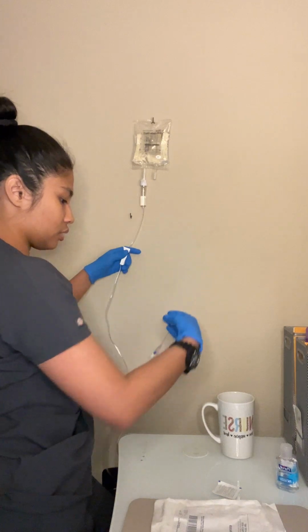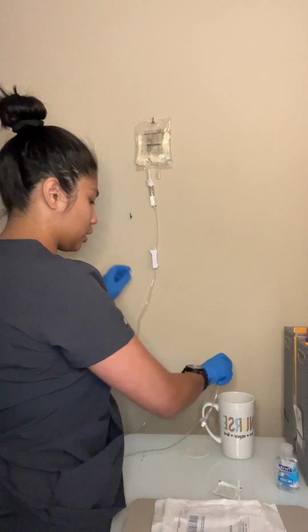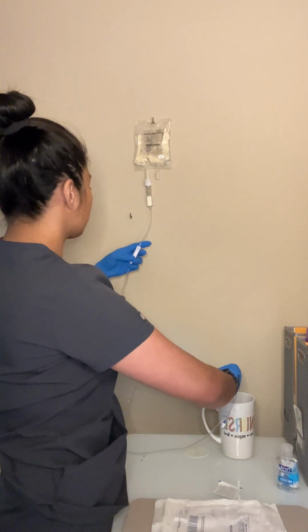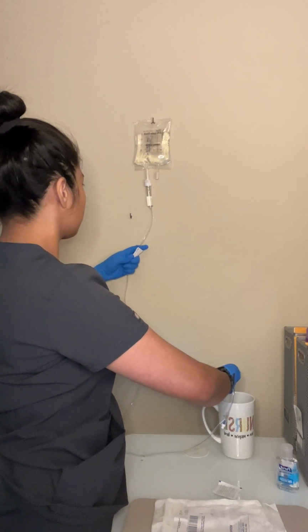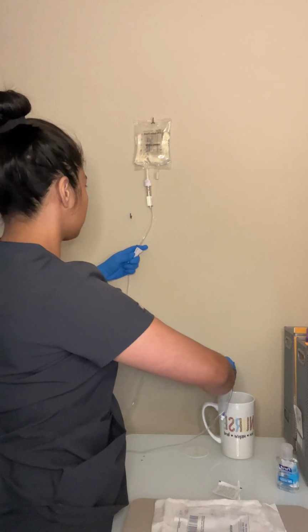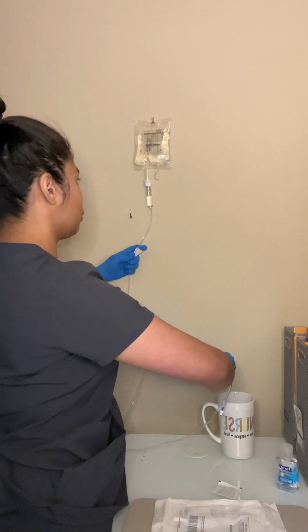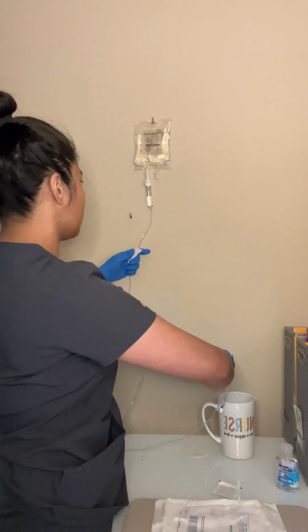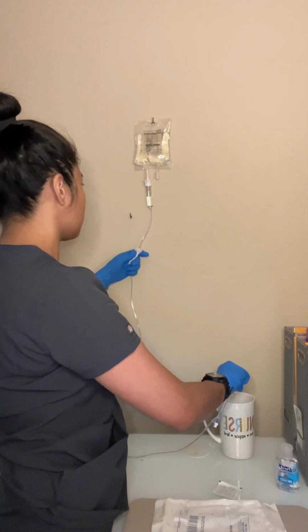You'll make sure that there are 38 drops in a minute, counting in a full minute, making sure that the patient will be receiving it at the correct rate.